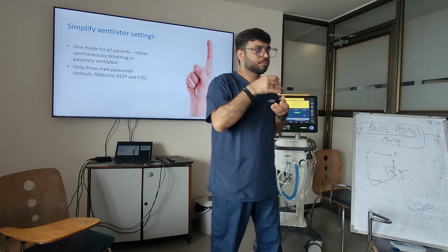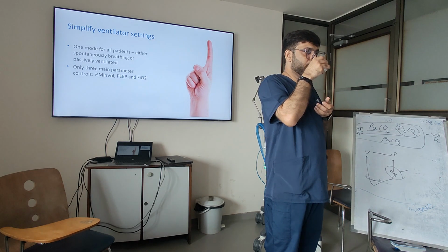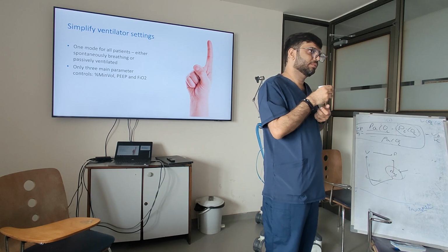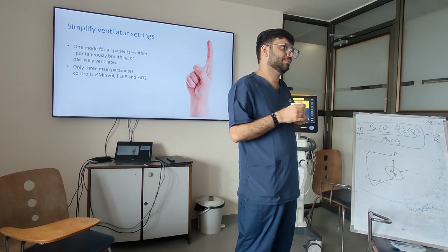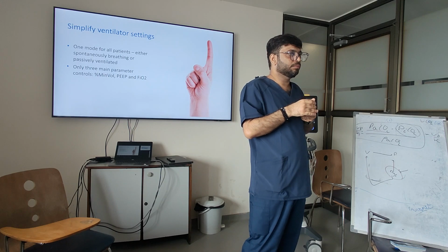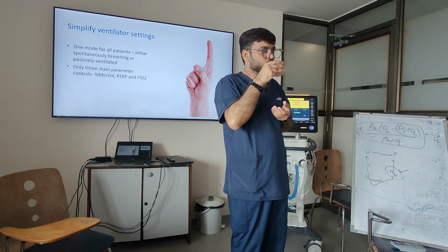Generally we go from volume control, pressure control to spontaneous breathing like a CPAP mode. But in the IntelliVent ventilator, because it analyzes the CO2 level, then RSBI, all spontaneous breathing senses, it automatically decides if the patient is ready. Now what happened to our patient? I don't want to know what it does. What happened to our patient?